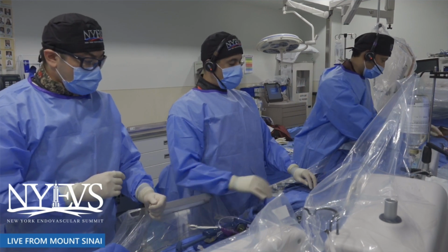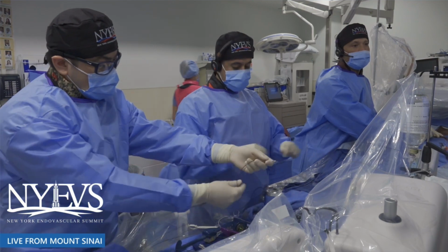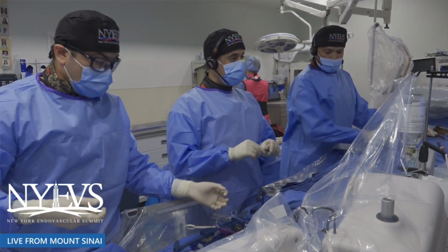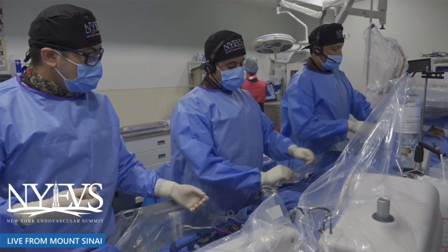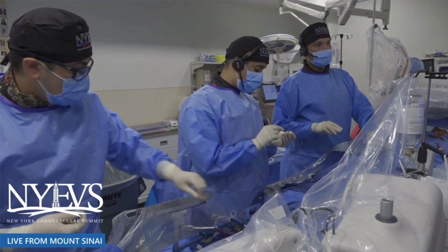So Darren, just a question for the panel, Joe, Yos, and as well: when you guys go into the aorta with these post-dilation balloons, obviously it's 8 and 8, it's a smallish diseased aorta. Do you worry about causing a retrograde dissection in the aorta with the 2 balloons? Is that something, without any axial imaging, like in this case?